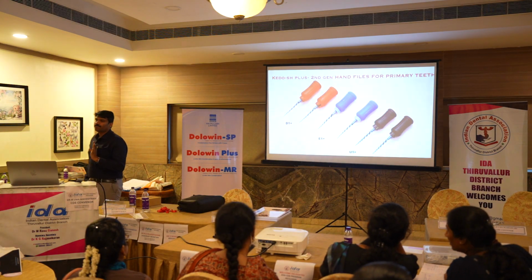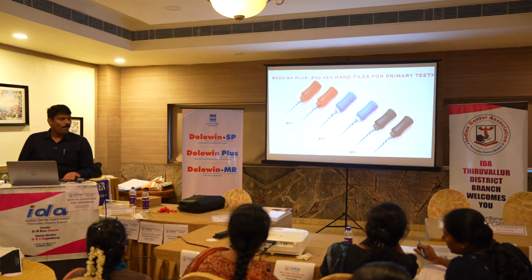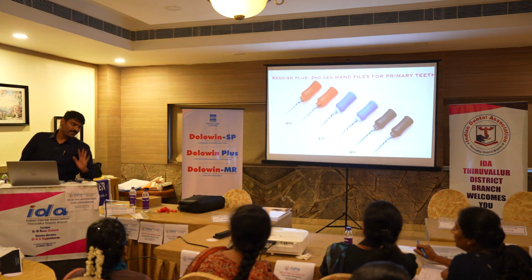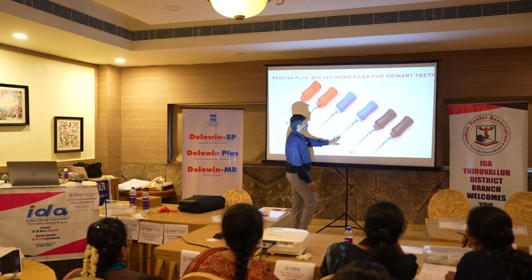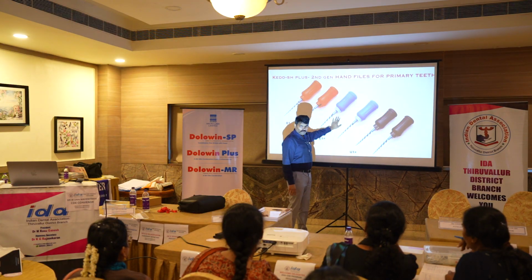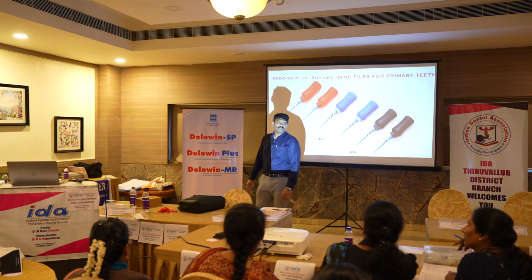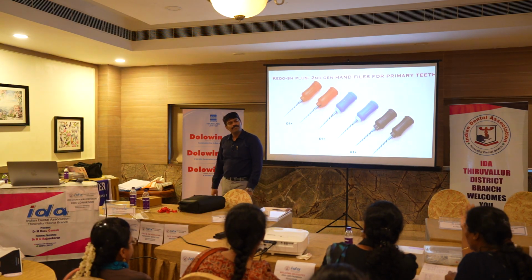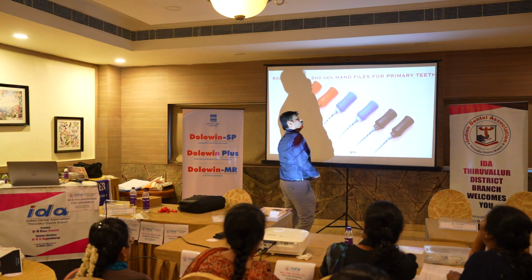Any doubts? Any doubts? Before I go to the next slide. Imagine you have only one file. In the red, black, there is one file now. In the red followed by blue for the molars. Only black for the anterior. Black. But for distal we need red and blue.